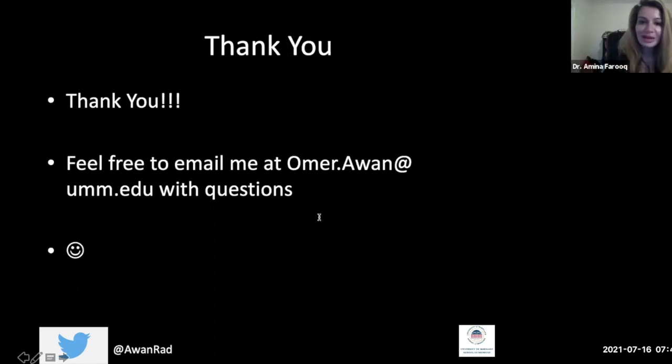Perfect. Okay. And then another question was, do you recommend ultrasound? There are a couple of questions asking about the role of ultrasound in arthritis. Sure. I love ultrasound. Ultrasound is actually my favorite modality for MSK. My residents will all tell you that.